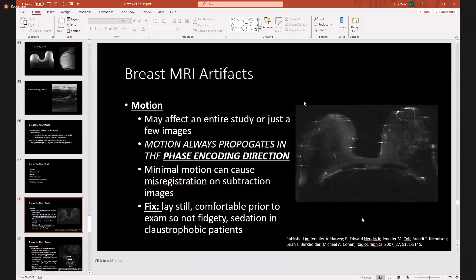Motion is pretty self-explanatory. It can affect an entire study or just a few images. For trainees in particular, remember that motion always propagates in the phase encoding direction. How do you fix it? The patient needs to lay still and be very comfortable prior to their exam so they're not fidgeting. Sometimes if the patient is really claustrophobic, they may need to be sedated.